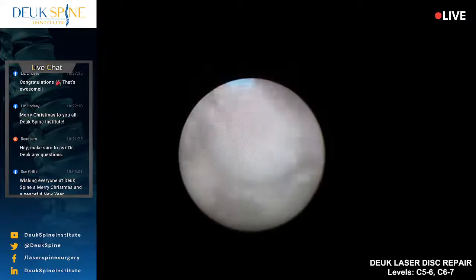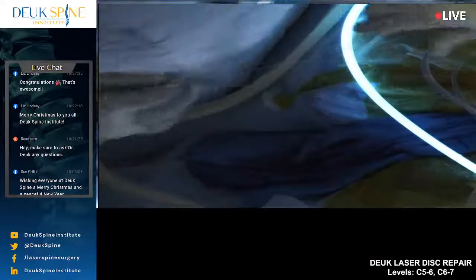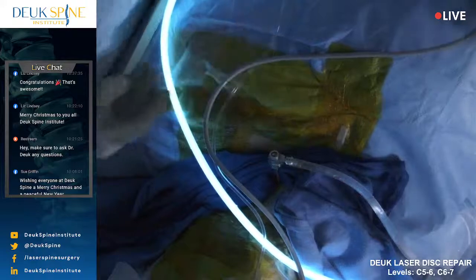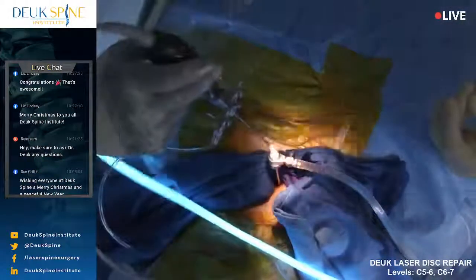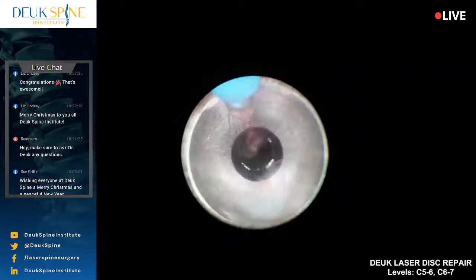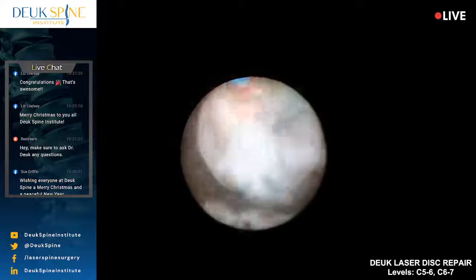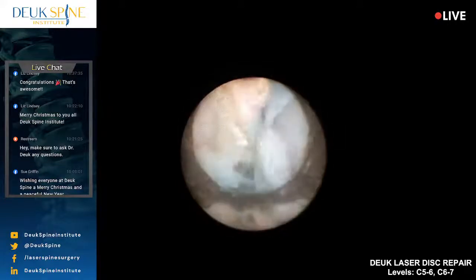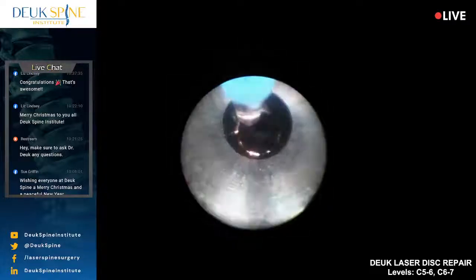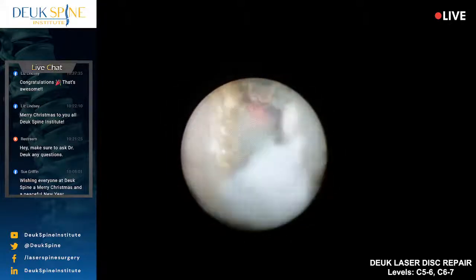How's our irrigation? It looks like we're running a little low. Yep, thank you. All right, we're going to be done in probably 15 minutes, doctor. So if you want to start winding down the anesthesia. Our patient is asleep under general endotracheal anesthesia. With chemical paralysis, we use, what do we use? Rocuronium. And then for general anesthesia, we're using sevoflurane. So we have a gas anesthesia. We'll probably convert the patient over to propofol from gas, or maybe just let it wear off. But we have an anesthesiologist who's here caring for our patients.